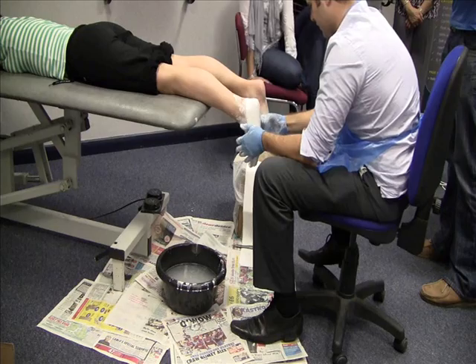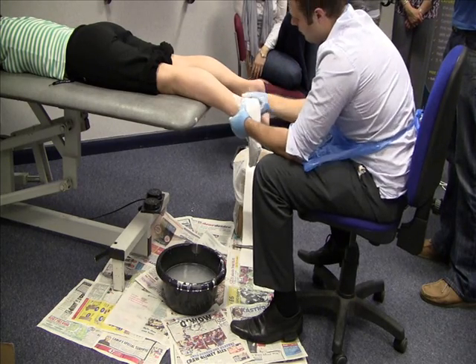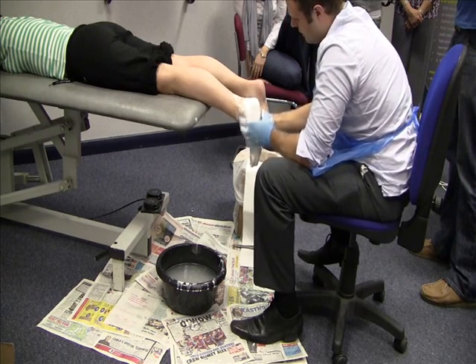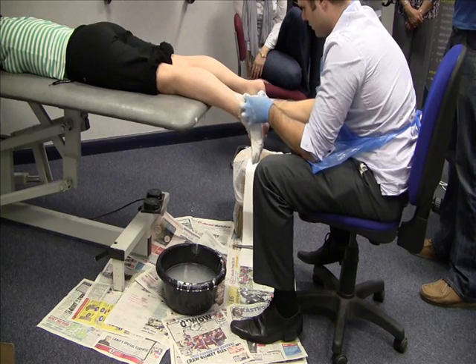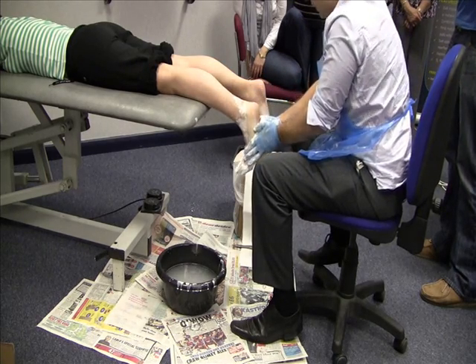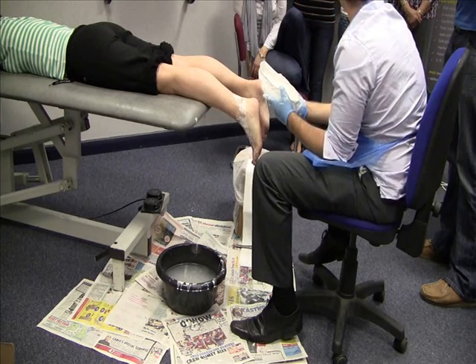Once you get to a certain point you can just hold that position. You can tell it's ready when it loses that shiny appearance and when you flick it, it starts to sound hollow. Once you're happy that it's beginning to dry, release the skin with one nice even grip, pull the cast off, and slide it down the foot and out.